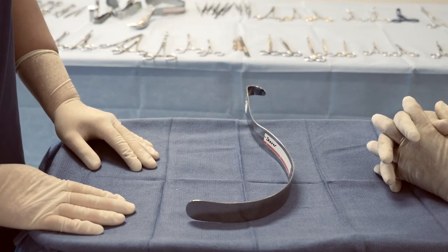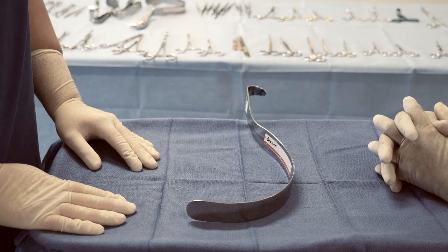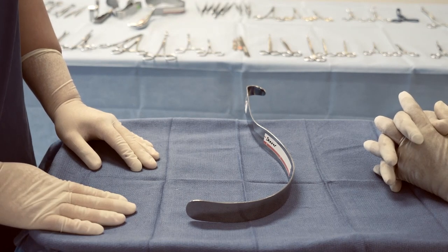This instrument is a retractor called a Deaver. It's used in surgeries that require retraction of deeper tissues. For example, in a laparotomy where they may need to retract the bowel.